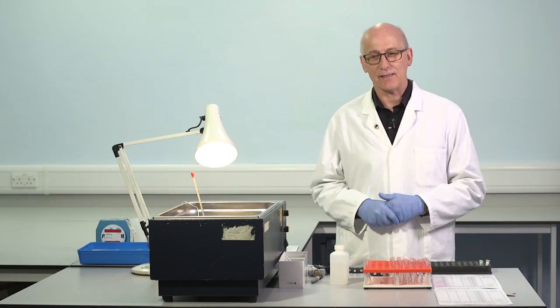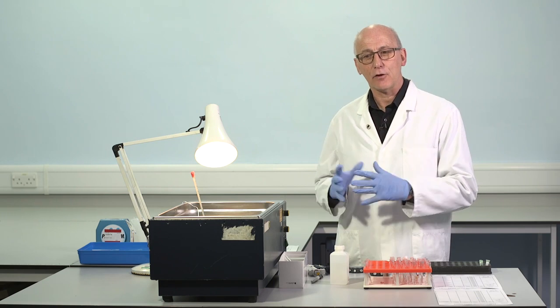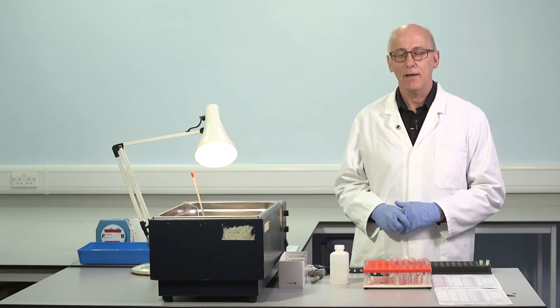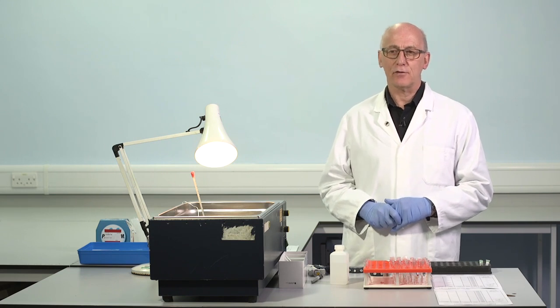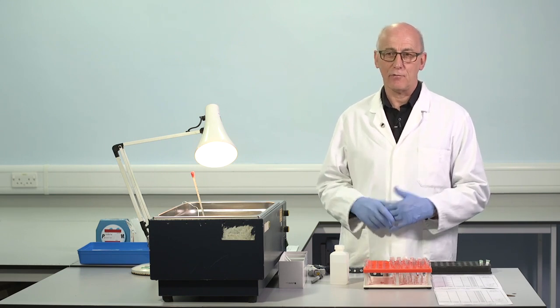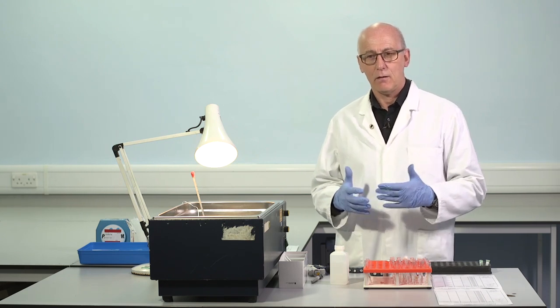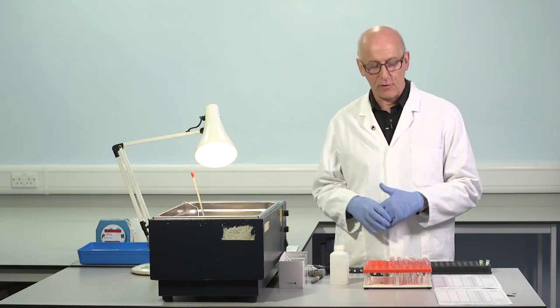And if we've got lupus anticoagulant present, that could have an impact on the results and clotting times during this assay. Therefore, there is some advantage to using an insensitive reagent, a reagent with a very high phospholipid concentration. This will minimize the impact of lupus as an interfering substance.